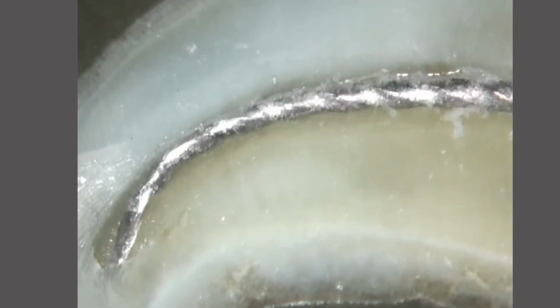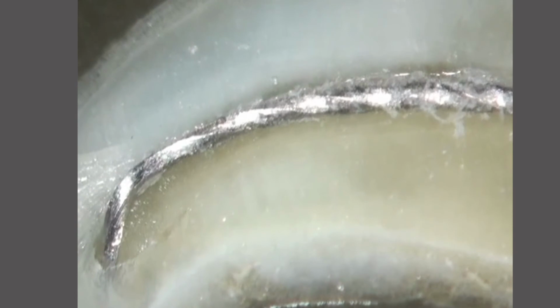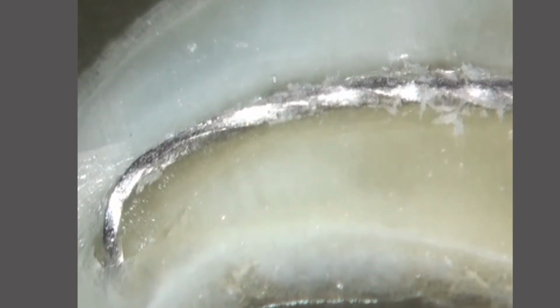I don't care how cheap or popular they may be, just try and avoid that, because that has a lot of consequences when it comes to obturation. Not to mention having that file push debris out the apex, post-op pain, complications with that, on and on. Nothing good comes out of a file that unwinds easily, okay? So it's something for you to make note of when it comes to instrumenting.